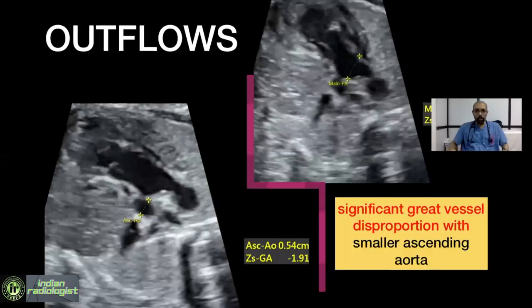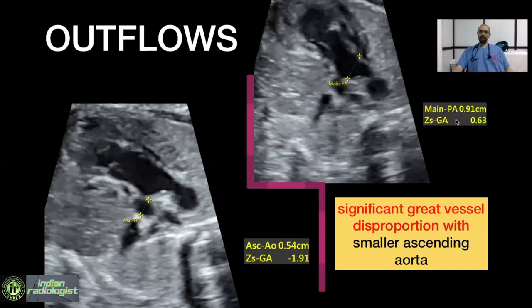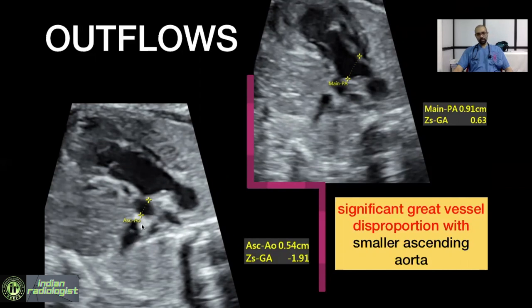Next, we have a three-vessel view where we can look at the pulmonary artery, the ascending aorta, and the SVC. The MPA measures 0.91 with a Z-score of 0.63, which is normal. However, the ascending aorta has a Z-score of minus 1.9. Another clue in this image is the size of the SVC — every time we see the SVC and adjacent aorta equal in size, or the SVC larger than the aorta, it hints that the child might have a smallish ascending aorta or be at risk of coarctation.